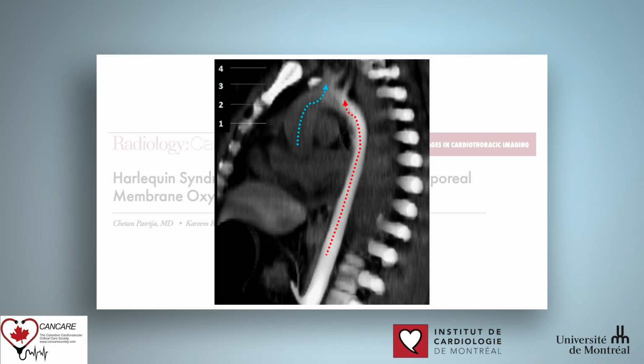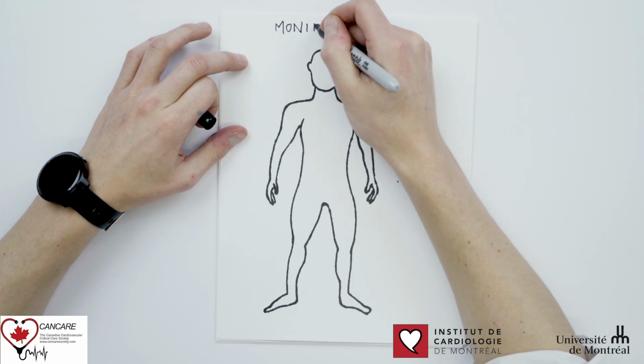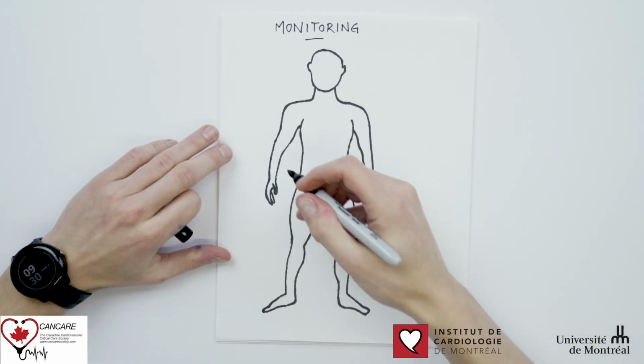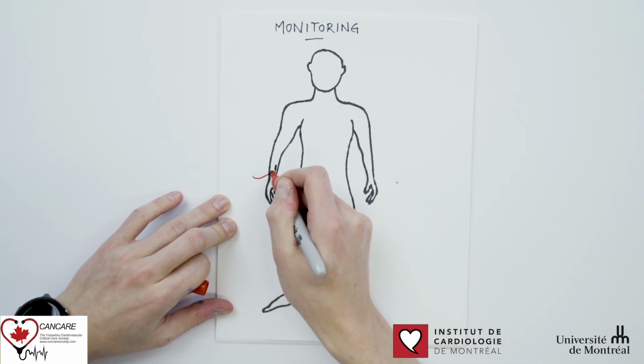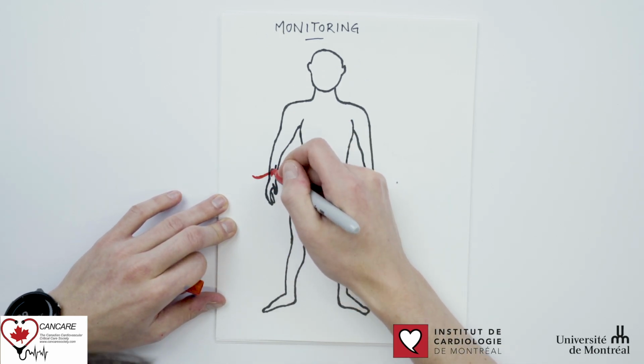Therefore, complete monitoring is critical to ensure early recognition. In order to detect differential hypoxemia early on, it is crucial to monitor the saturation of the upper body as well as cardiac function. Upper body saturation can be monitored using a variety of measurements.